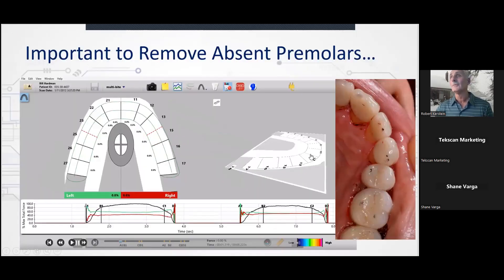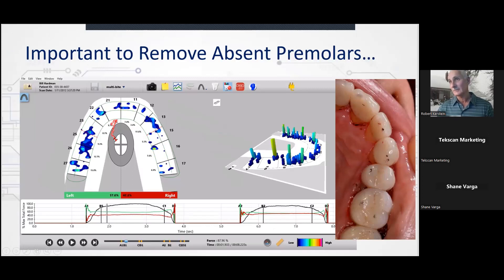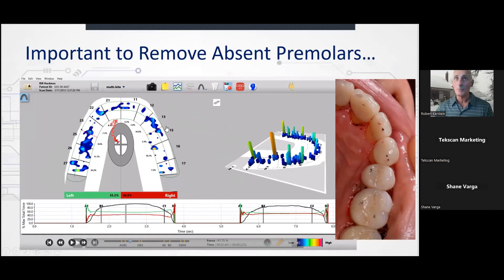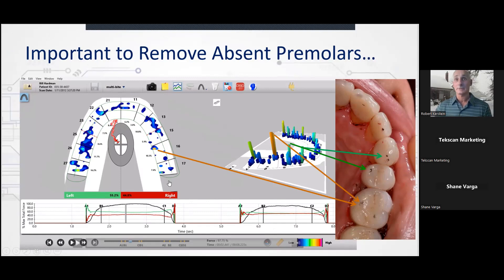Don't forget to remove premolars. Here's a prosthetic veneer case being inserted — one premolar on each side. Look at the data: very important to be able to do that. If you don't take out your premolars and don't gray out your third molars, you won't have an accurate arch.